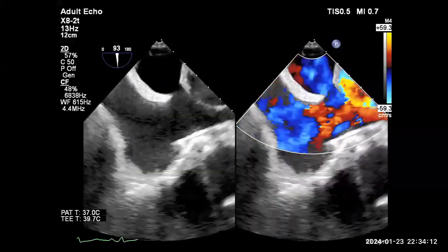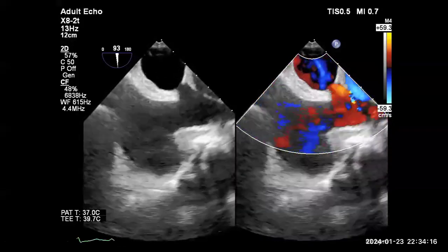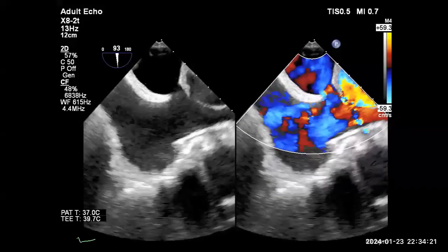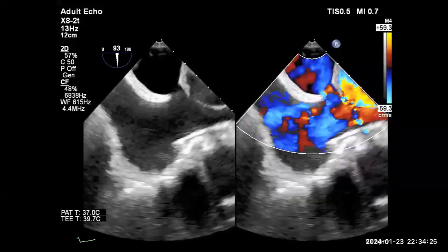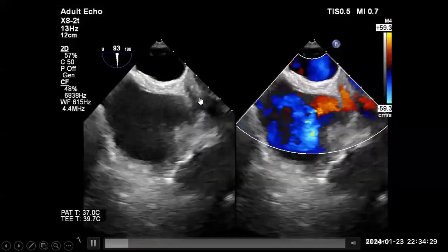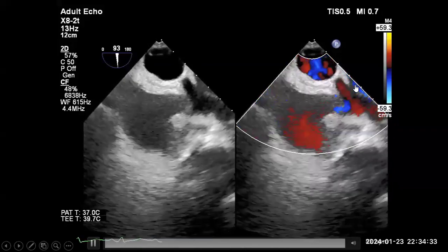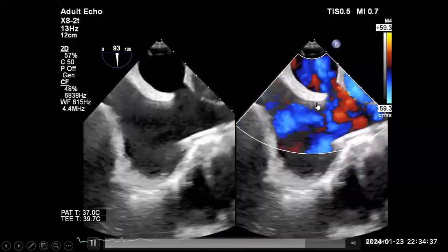What's the common association with a pulmonary drainage abnormality? So one of the pulmonary veins was draining directly to the RA instead of the LA. This is one of the rare cases that you will face, a case of sinus venosus SVC with bidirectional flow, small, more left to right, but here from the color you can see that there is blood coming up and in both directions.